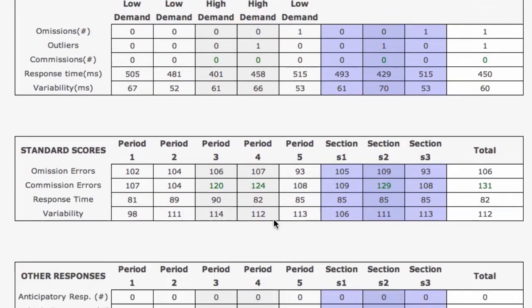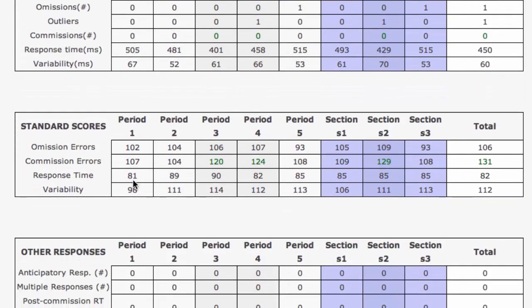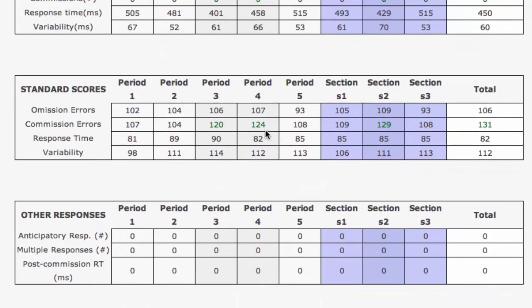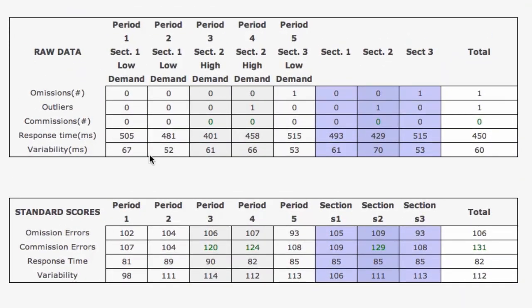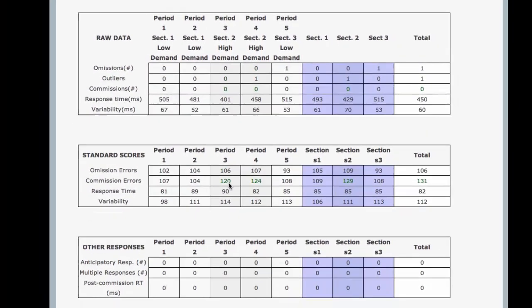Now we go down into the standard scores, broken out in the same manner into 5 periods, 3 sections, and total. The standard scores will change color as will the raw data — green if you break 120 on the standard score, and red if you break 80. There are a couple other spots where you'll see red numbers, such as post-commission response time, anticipatory responses, multiple responses, and so forth.